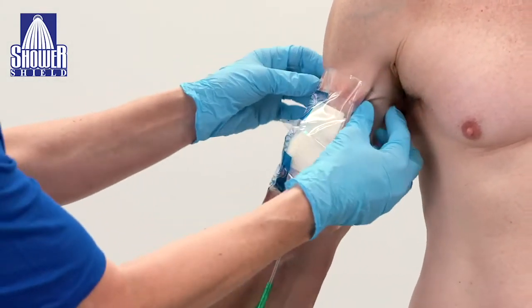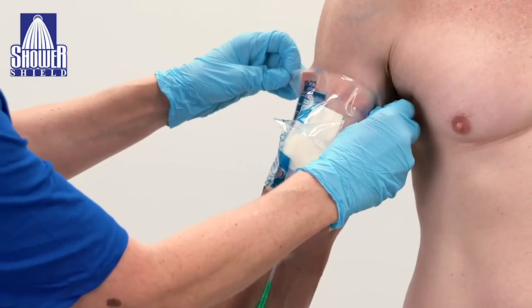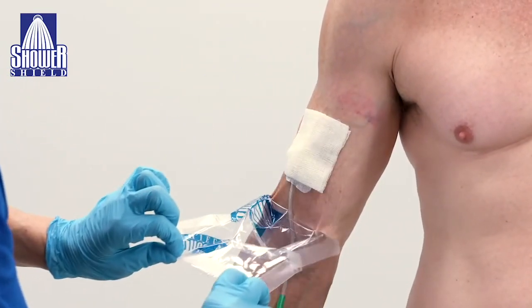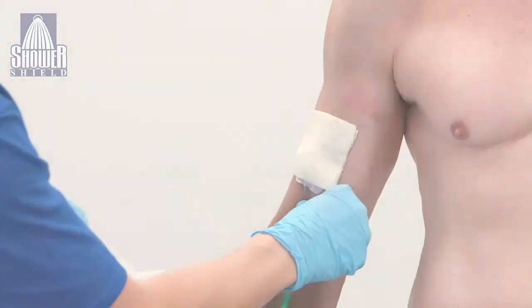For removal, ensure that the exterior is completely dry and gently peel down from the top edge. For sensitive skin, you may need an adhesive remover, but most dressings will be removed easily.